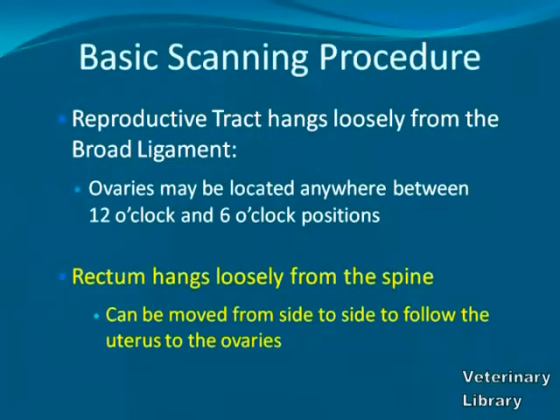Thus, locating and finding the uterus will be your best guide to the ovaries. Since the rectum hangs loosely from the spine, it can be moved from one side to the other so that you can follow the uterus to the ovaries.